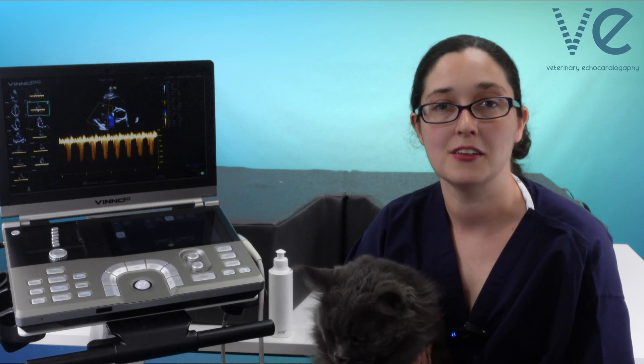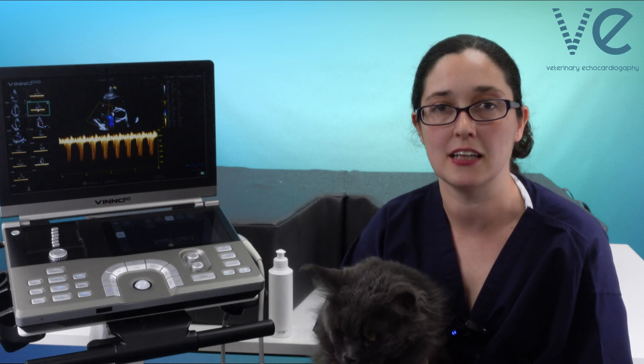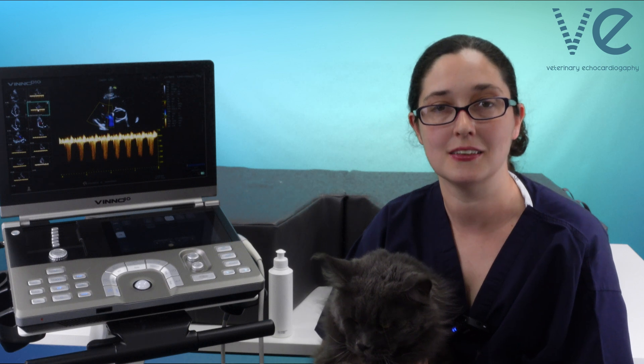If you come across a patient even with mild tricuspid regurgitation, it's a great opportunity to get a trace through that regurgitant jet so that you can estimate your patient's pulmonary pressures and risk of pulmonary hypertension. In this video, I'm going to show you how you can do this from multiple views.